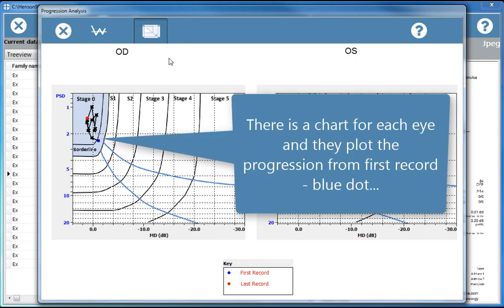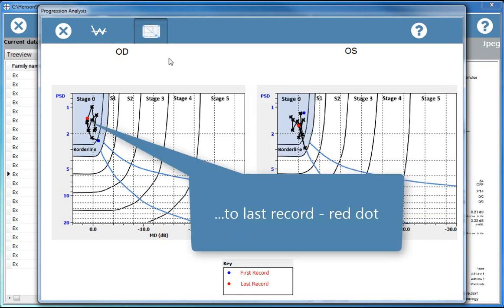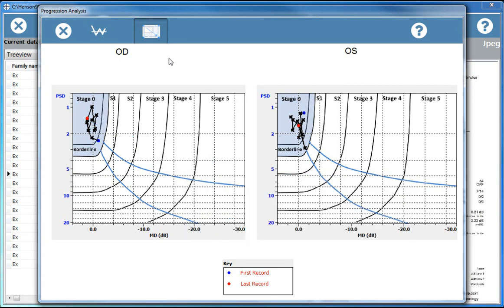There is a chart for each eye and they plot the progression from first record, blue dot, to last record, red dot.